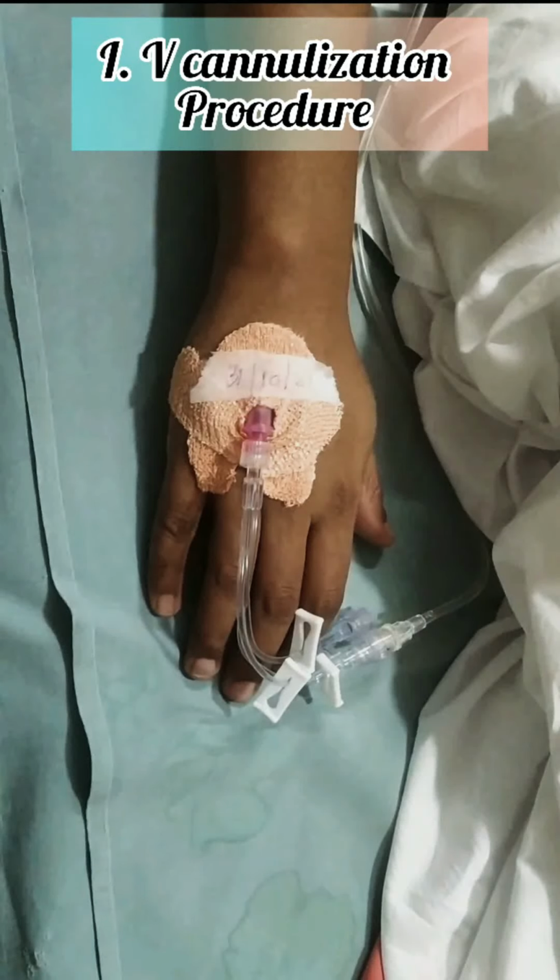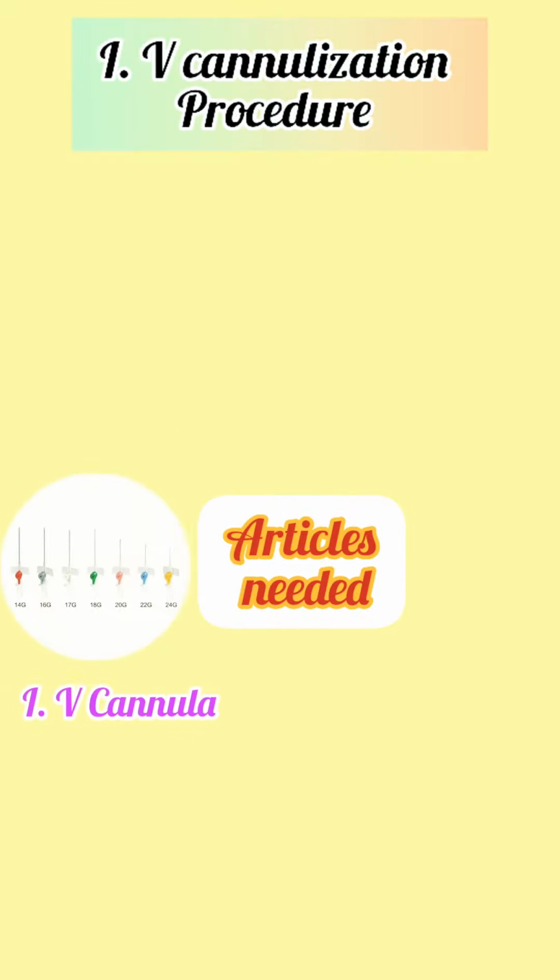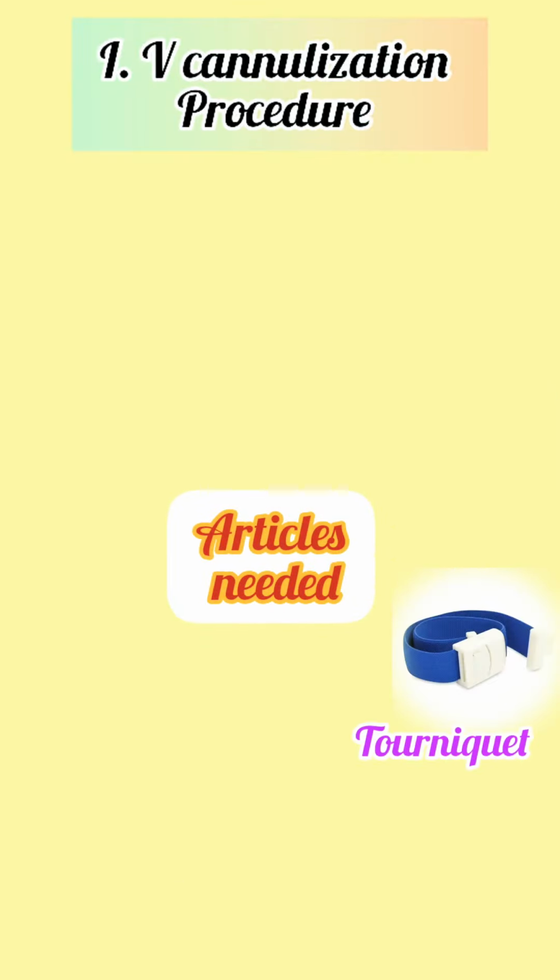Hey learners, today we will see how we can do the IV cannulization. So these are the articles which we need for doing the IV cannulization.